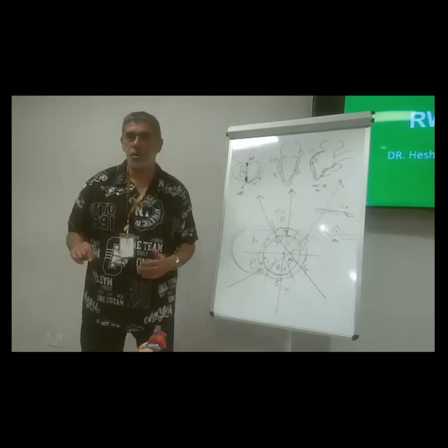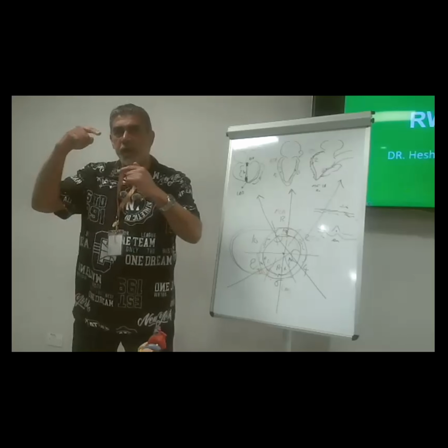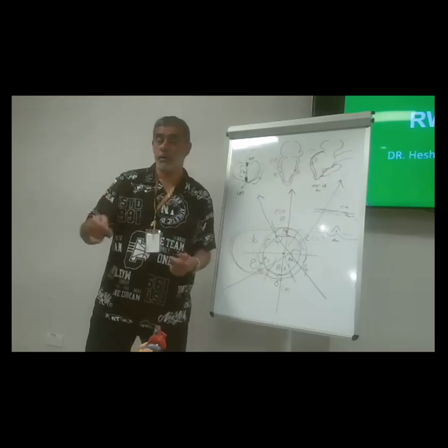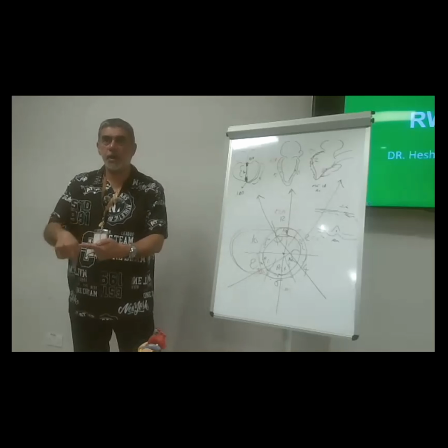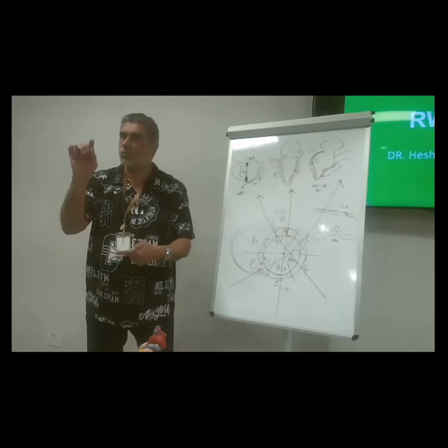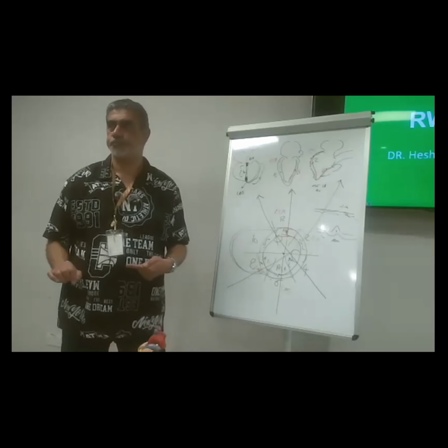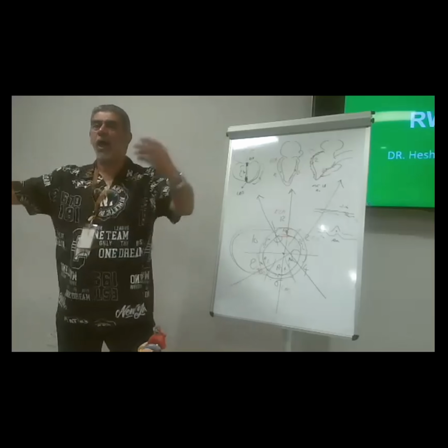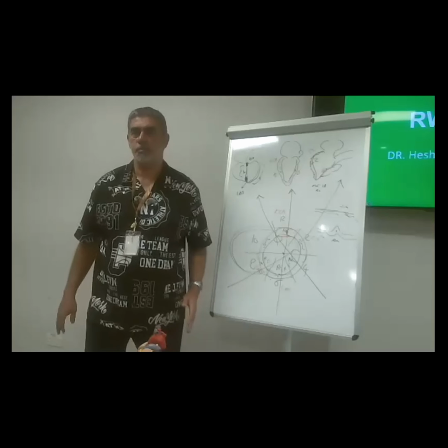He knows that the anastomosis of the mammary to the LAD was not optimal, or the target area he chose for the anastomosis was not optimal. There is nothing to do except going on bypass again and doing a new anastomosis.